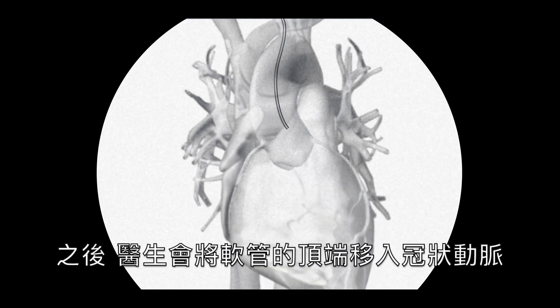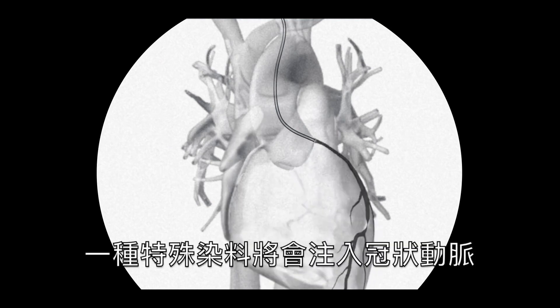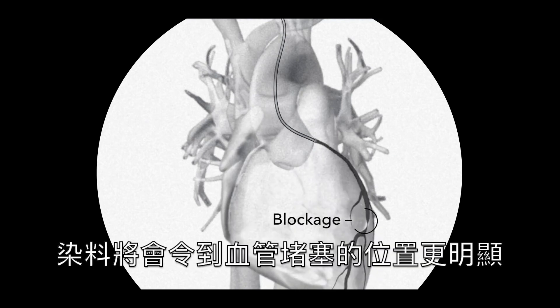Then, the doctor will move the tip of the catheter just inside the coronary artery to be examined. A special dye will be injected into the artery. This allows your doctor to view it better with the fluoroscope. The dye will make any blockages in the artery stand out.